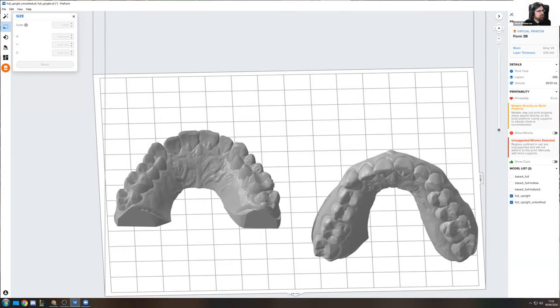So I actually see there are a couple more questions towards the Preform software. So there are a couple of questions on hollowing out a model. Just as soon as said, this is a thing that will also come into 3Shape in the near future. A software that I'm using that is actually free is called Mesh Mixer. There's a very nice and easy to use hollow function in there, which can also input suction holes into your model by just double clicking on the model itself.